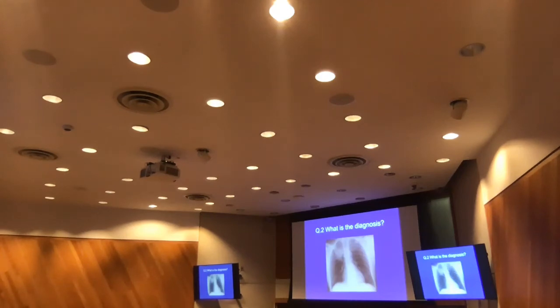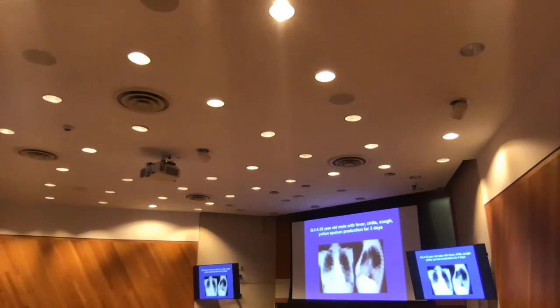Is this abnormality present on the left side? You can see, not present on the left side. This is the abnormal density that we have already found. Now, the normal chest X-ray should not have that. What is this? It's the CT scan of the same area, right side. The diagnosis is number 3.